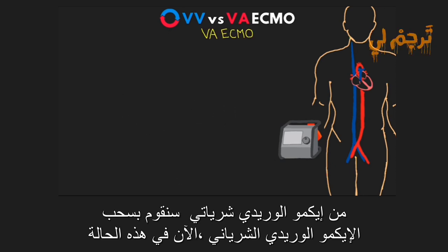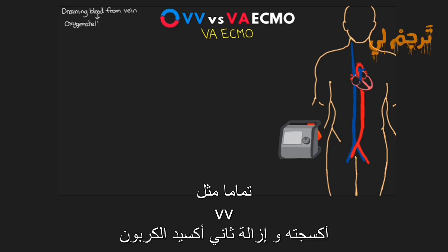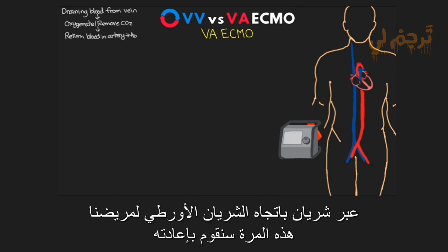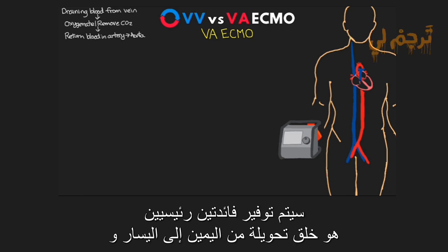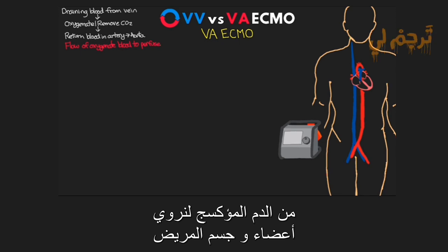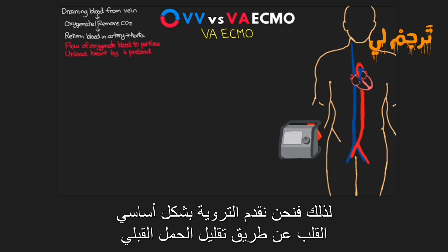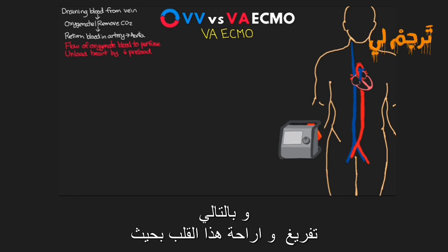Now, in the case of VA ECMO, we're going to be draining blood from a vein, oxygenating it and removing carbon dioxide just like VV. This time we're going to be returning it to an artery towards our patient's aorta. And so here what we're effectively creating is a right to left shunt, and it's going to be providing two main benefits. First, it's going to give a stable flow of oxygenated blood to perfuse our patient's organs and body. And it's also going to be unloading the failing heart by reducing preload. So essentially we're providing perfusion of oxygen for the body when the heart's really not able to do it itself, while also unloading and resting that heart so it can recover.